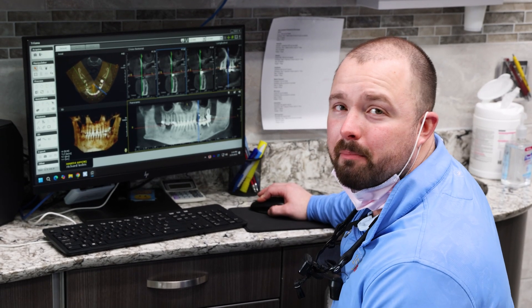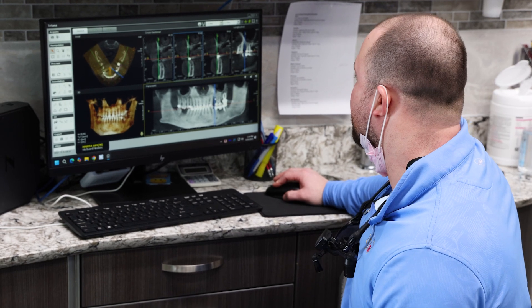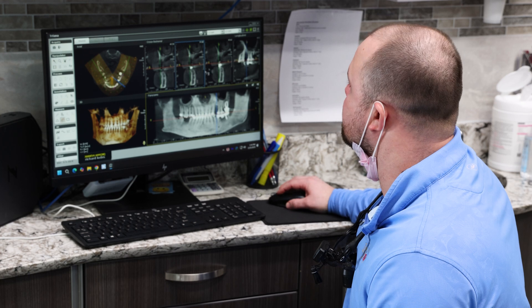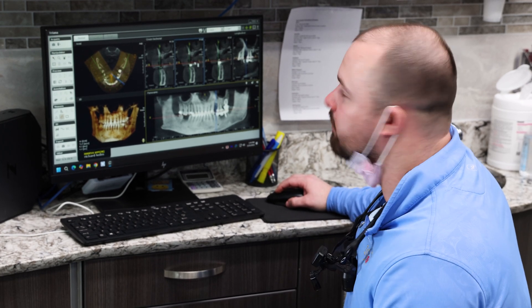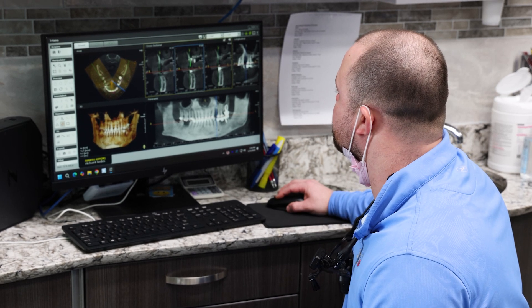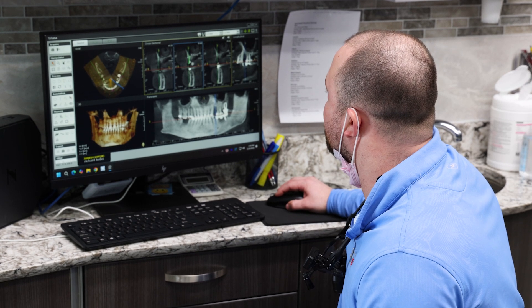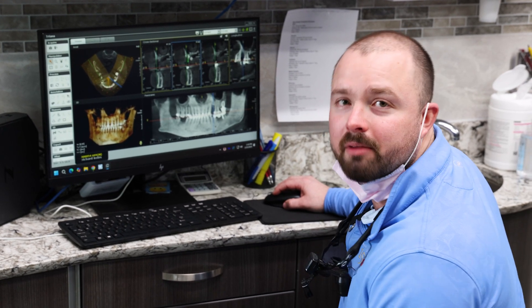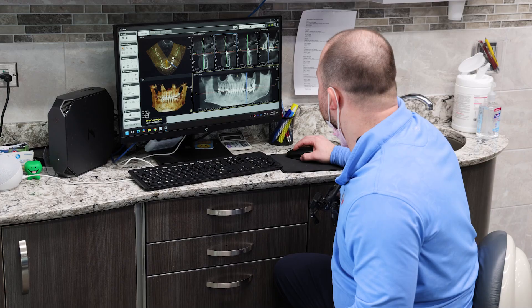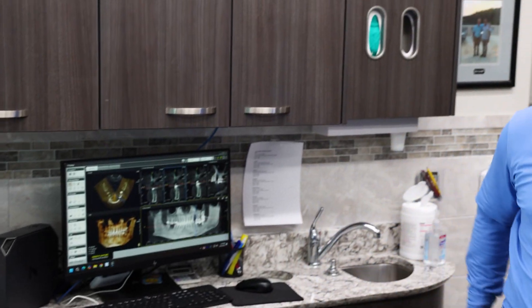I extracted this tooth a couple months ago and we gave it about three months to heal. We're going to place a mini there because the bone is dense enough in the distal part near number 13, where I'll be able to get some nice bone and place a solid implant. I'm going to use a 2513 because from where the gum tissue to the bone ends it's about 15 millimeters. I'll give myself a little buffer until it gets to the sinus, and I'm going to place a little more distally towards 13 because that's where the densest bone is.